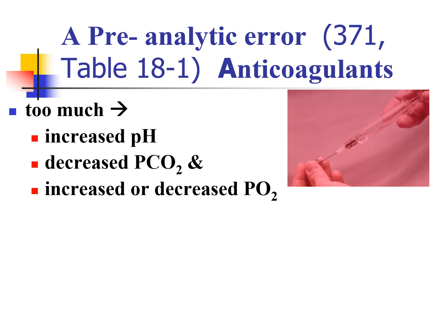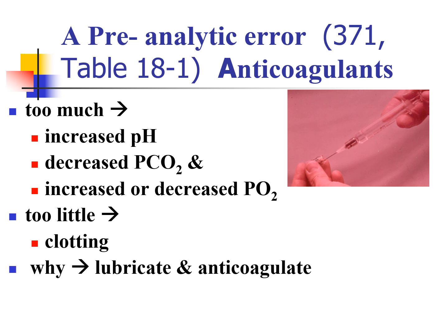But you do need to remember that the blood gas results could be altered if there's too much heparin in theory in that syringe. That's why you never want to draw super small amounts. Super small amounts will actually increase their pH and decrease their CO2 and make it appear that the patient is in a different acid-base balance than what they are actually in. If there's too little heparin, then you're going to have an issue with clotting in the syringe itself, which means we can't run the gas, which means we're not going to get the information, which means you poked a hole in someone's artery for no reason, and now you have to do it again. Trust me, patients don't like it when you have to redraw a blood gas.